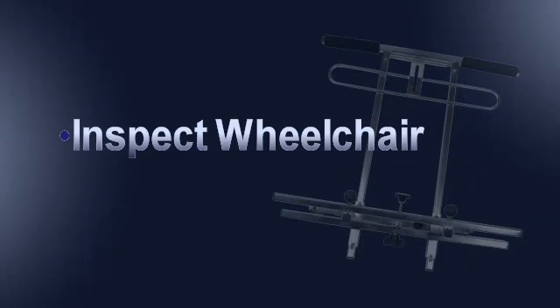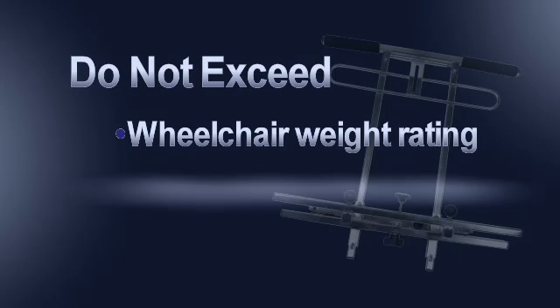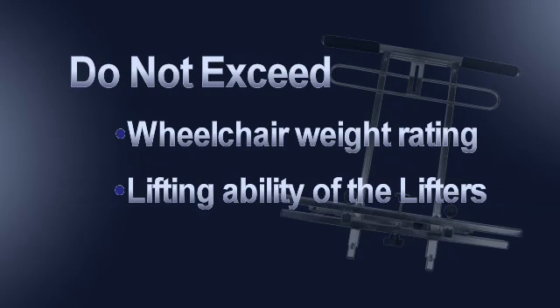Inspect the wheelchair frame, seat, and backrest to ensure they are all in clean, safe working order prior to kit installation. Never exceed the rated weight of the wheelchair or the ability of the lifters to support the weight of the wheelchair and passenger.